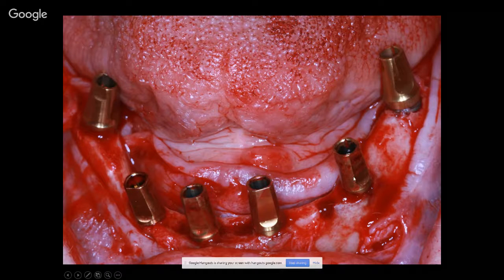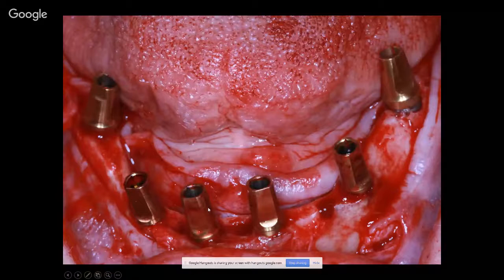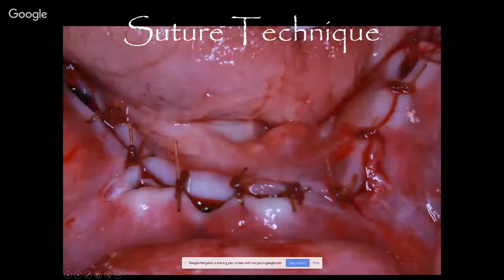And I think probably the most important thing I like to point out of this image, and I presented this in Washington, D.C. the following year in 2011 at the AEID conference, is I kept these abutments on and I loosely sutured with Gore-Tex sutures. These are 3.8 millimeters, approximately 4 millimeter implants, and these are approximately 4 millimeter abutments. I left the tissue out on all of these areas and allowed for secondary granulation to occur.